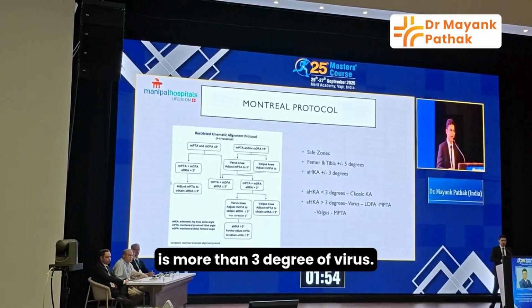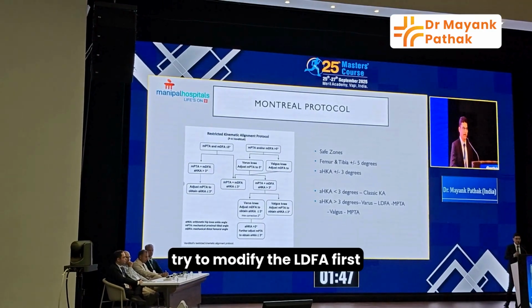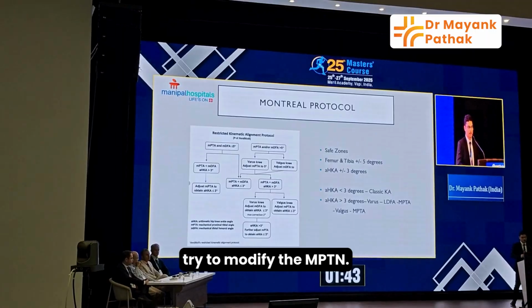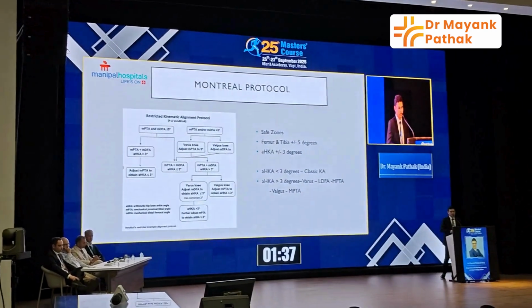And if it is more than 3 degrees of varus, in a varus knee we try to modify the LDFA first and then the MPTA, and in the valgus knee, we try to modify the MPTA. But we try to stay in the safe zone as much as possible.